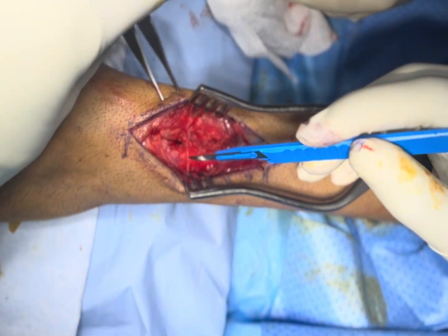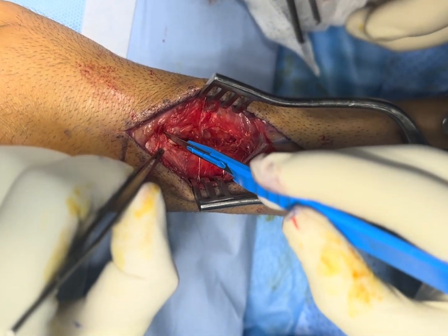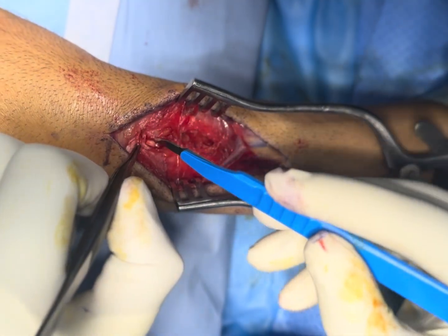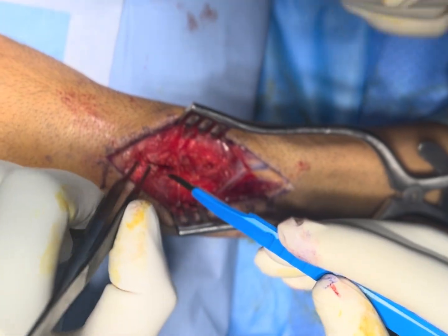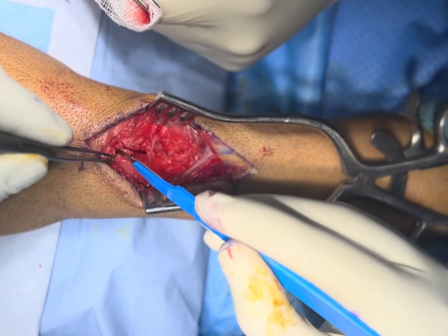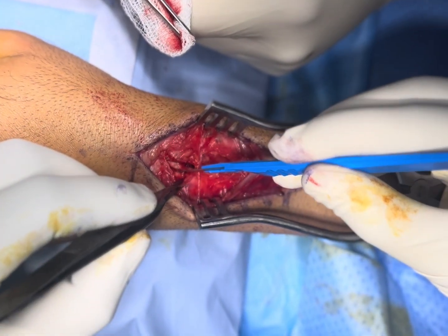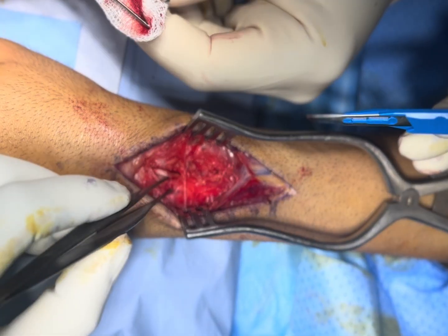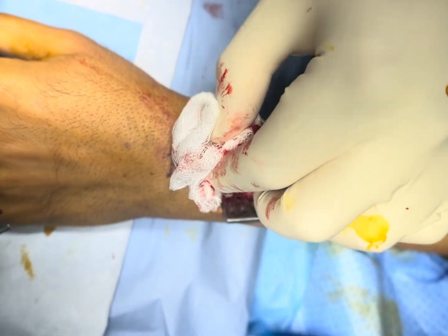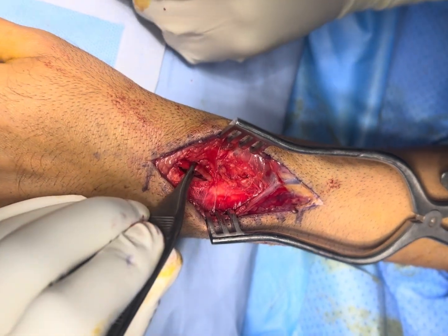I have given a small nick to identify the EPL tendon, and just along the tendon you have to excise the extensor retinaculum. You can see clearly that the tendon is moving. To confirm you are in the right place, extend the thumb — you can see the thumb movement, confirming correct position.